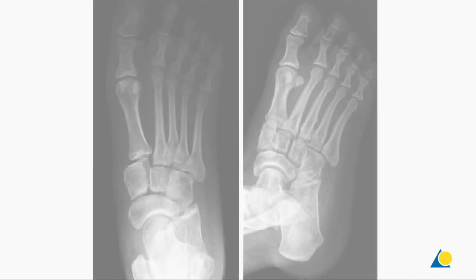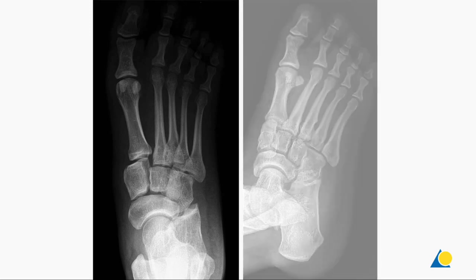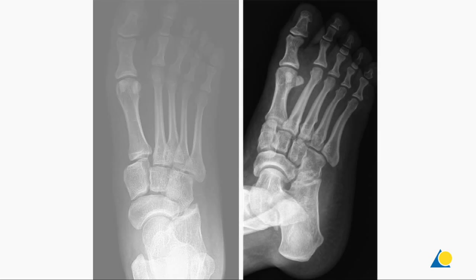Here we see examples of an AP and oblique view of a Lisfranc injury. In the AP view, it can be seen that the first MT is tipped off the medial cuneiform and the first TMT is tipped out of place. The 30-degree oblique view shows the second TMT displaced laterally.